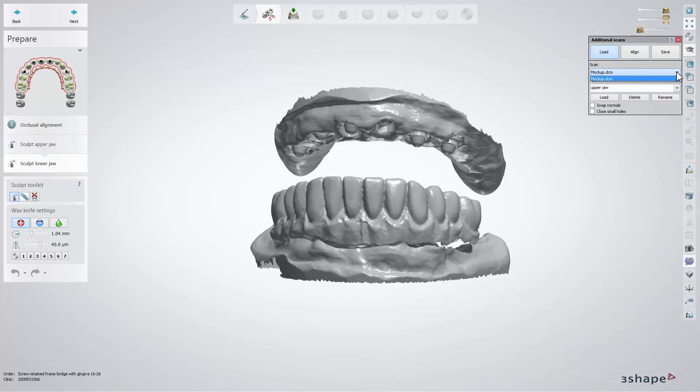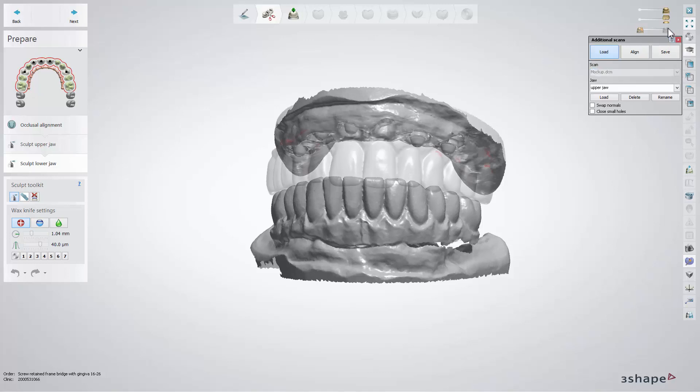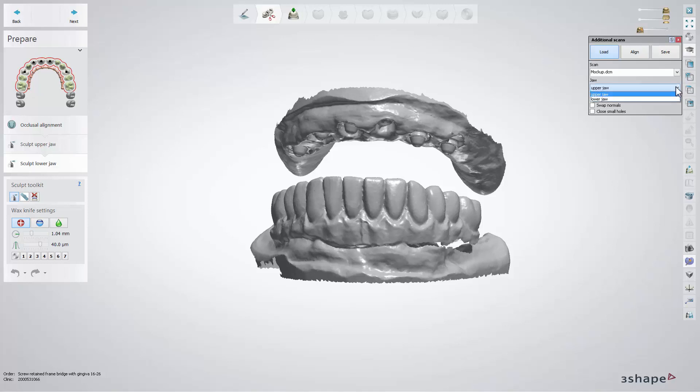Each scan needs to be linked to the upper or lower jaw by choosing it from the drop-down list. This link is needed to identify the jaw to which the scan should be aligned.